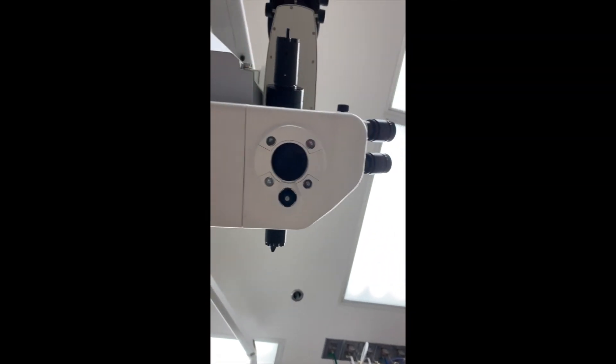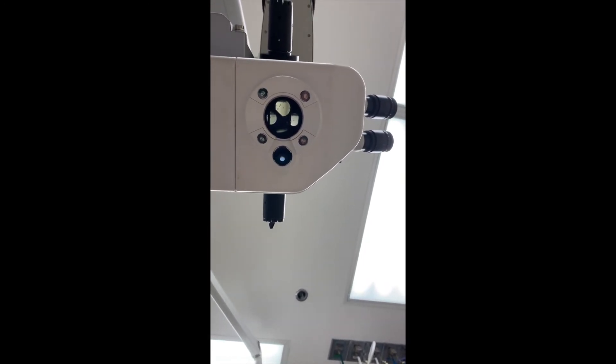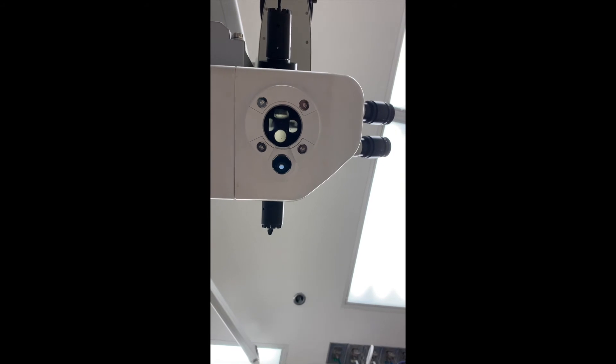During surgery, you'll see there's a microscope, and when we tilt up, you'll see the four lights. Those lights are what we use when you're in the middle of surgery — you just look at them. Right now it's off, but those four lights are what you look at during the surgery.